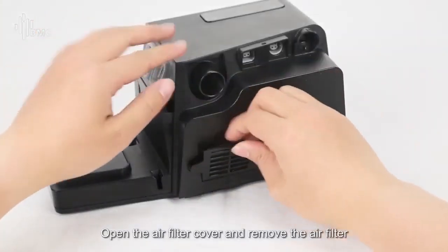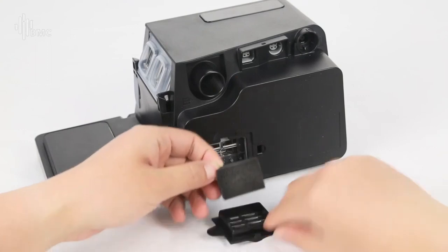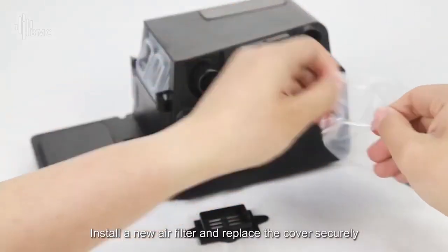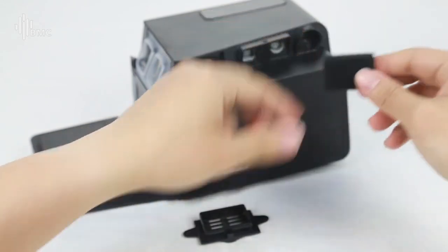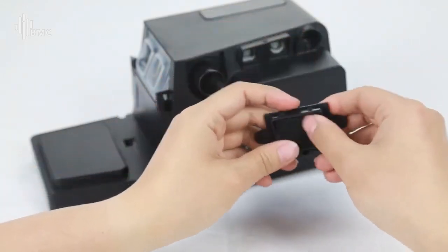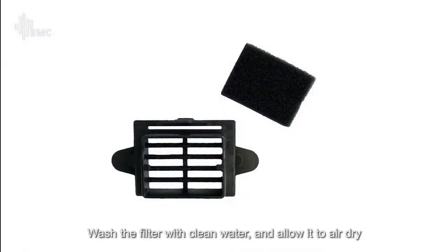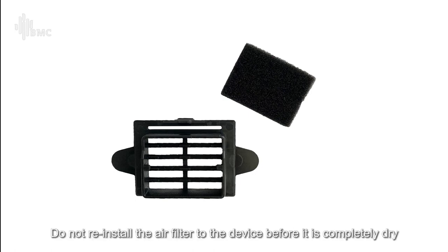Open the air filter cover and remove the air filter. Install a new air filter and replace the cover securely. Wash the filter with clean water and allow it to air dry. Do not reinstall the air filter to the device before it is completely dry.